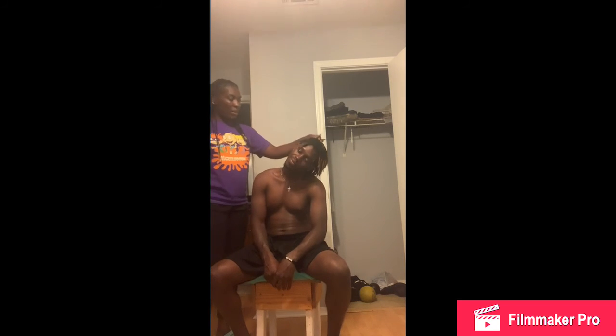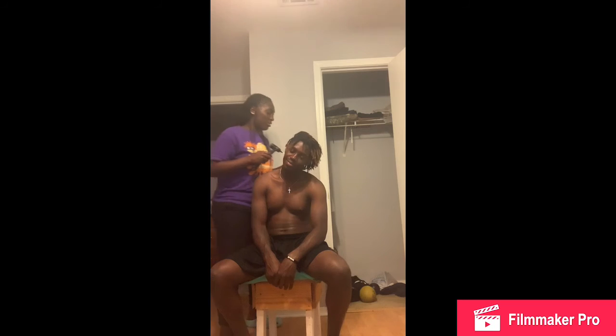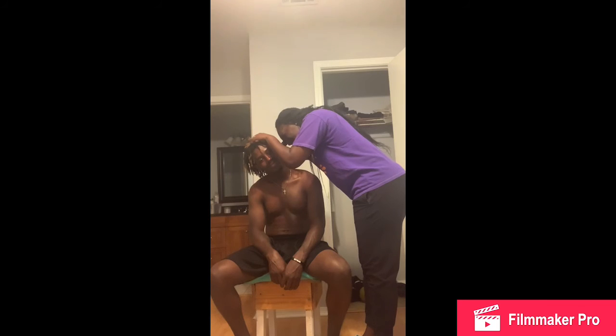All right. So first, I want you to tilt your head for me. This is an otoscope, and I'm just going to look inside your ear. Okay. All right. Do the other side for me. All right.